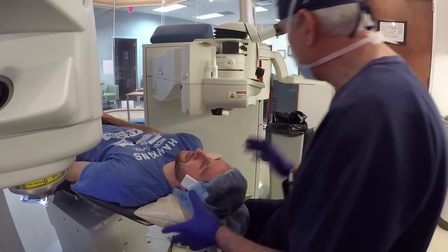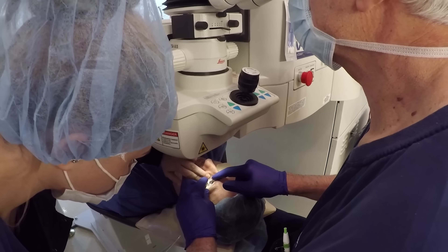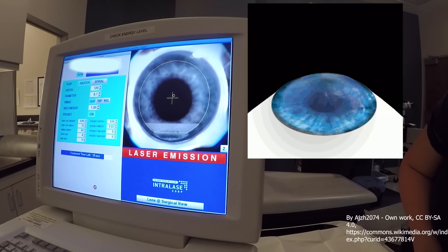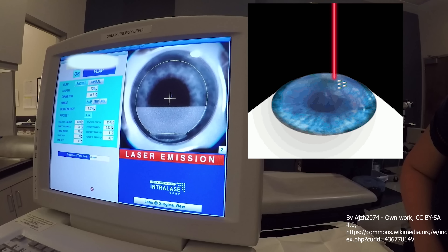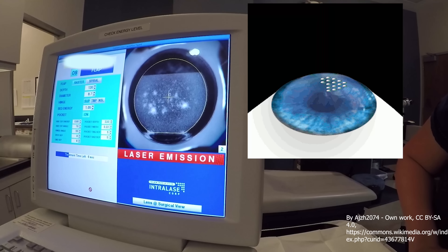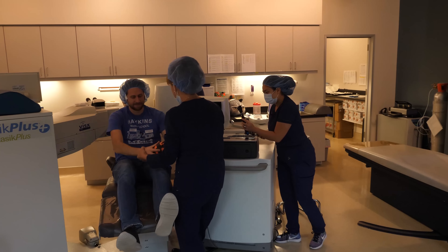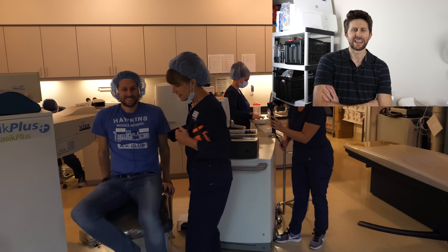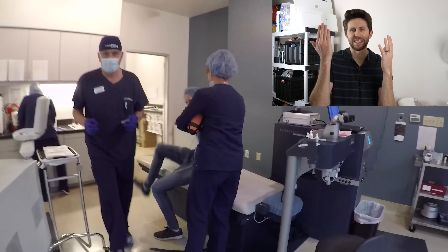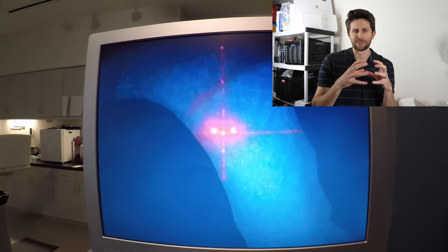Now for the other eye — same thing with the left eye. At this point, they help me up and it's just foggy — I can't really see anything because there's a gap under my cornea filled with gases making it foggy. Then I move to the different laser, the one with the waveguide that actually shapes my cornea. This is the cool part — the surgeon has to get in there and pull that corneal flap up.